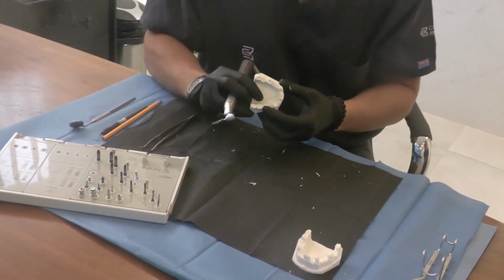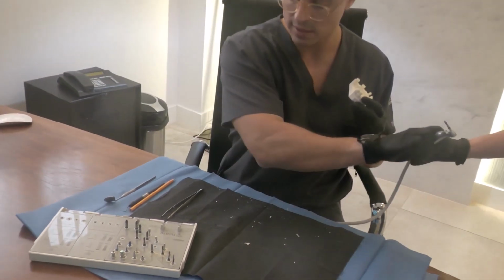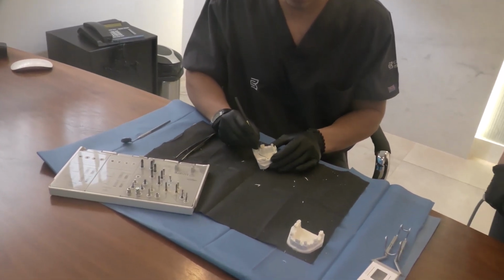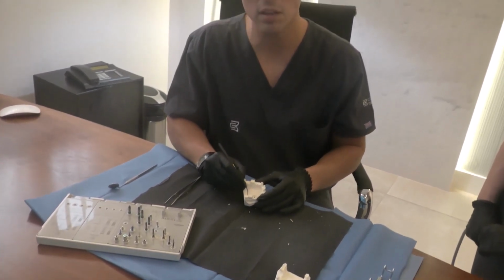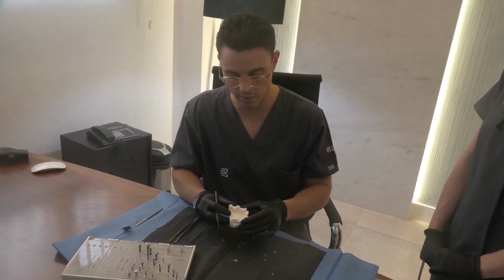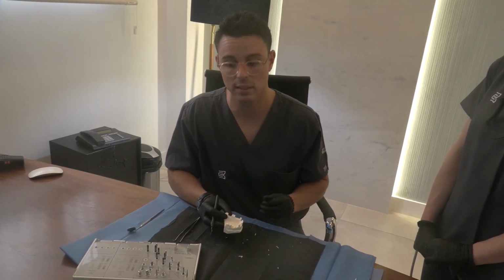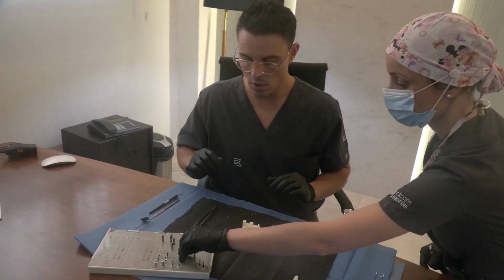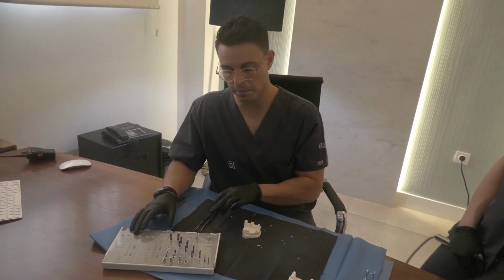Okay, and here you can see how it was drilled right in the center of the alveolar bone, warranting a decent distance from the adjacent teeth, and also in order to guarantee an adequate emergence profile, which should always avoid convexities in the molar areas in order to minimize food impaction. Now, what is the next step?